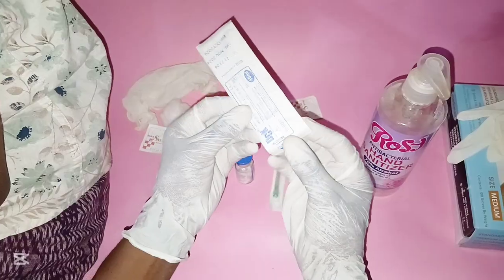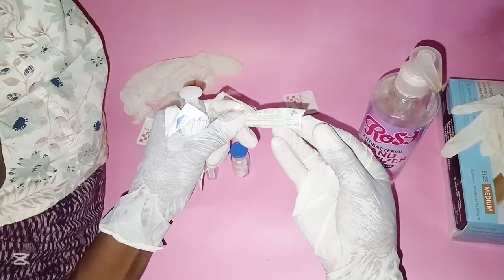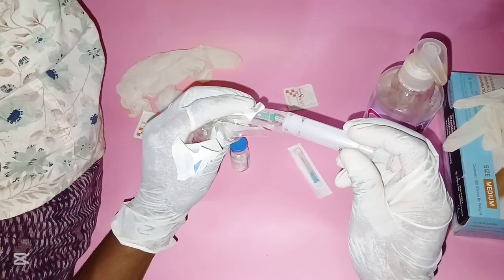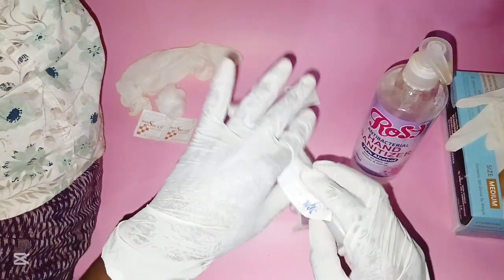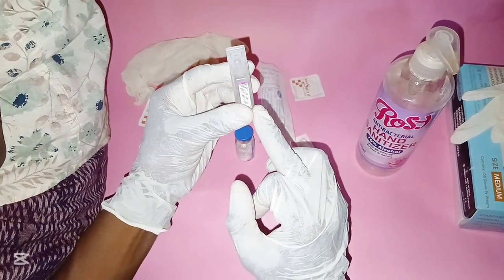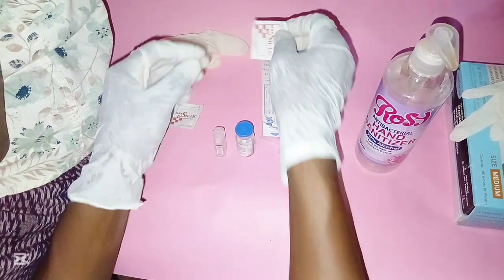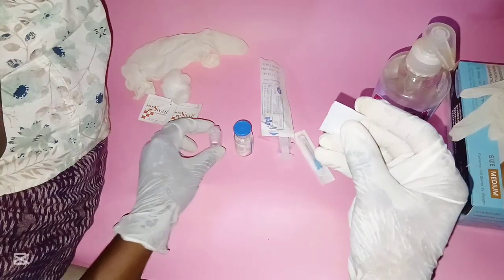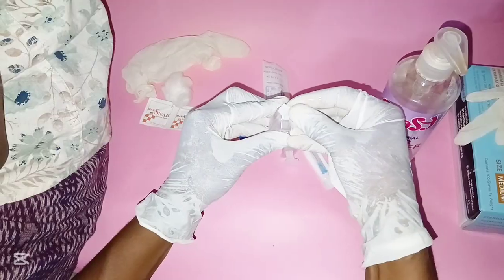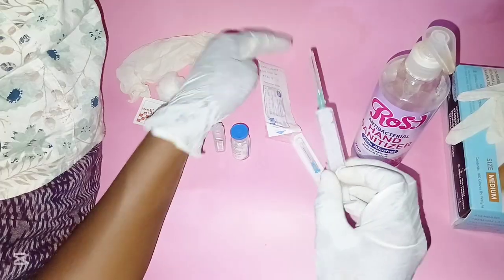Get a 10 ml syringe, remove it from the packaging, and get a 21 gauge needle to reconstitute the drug. Attach the syringe to the needle. Get the plastic vial containing the sterile water for injection, flip off the cap, open the vial, then clean the top with an alcohol swab for at least 20 seconds and allow it to dry.